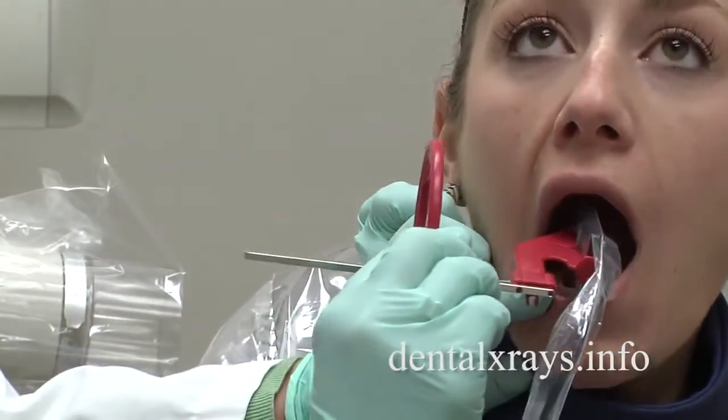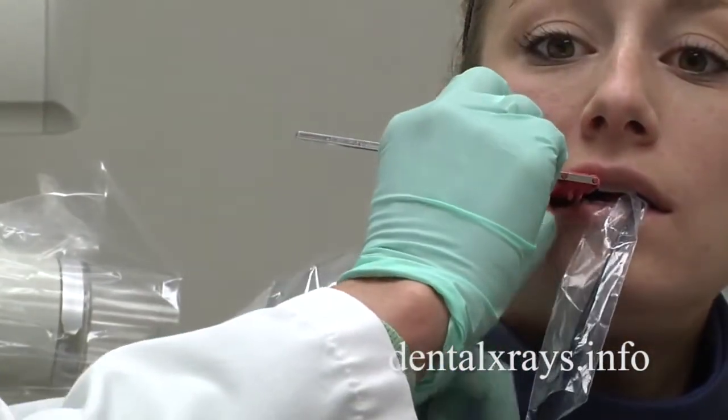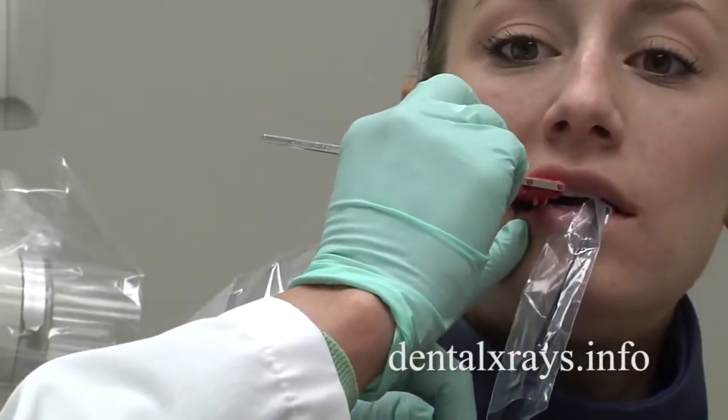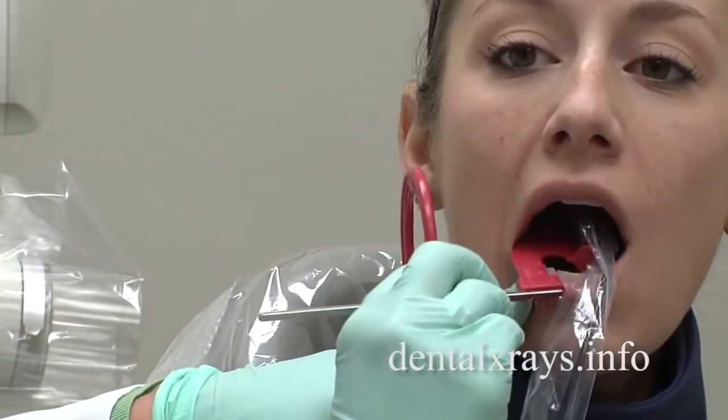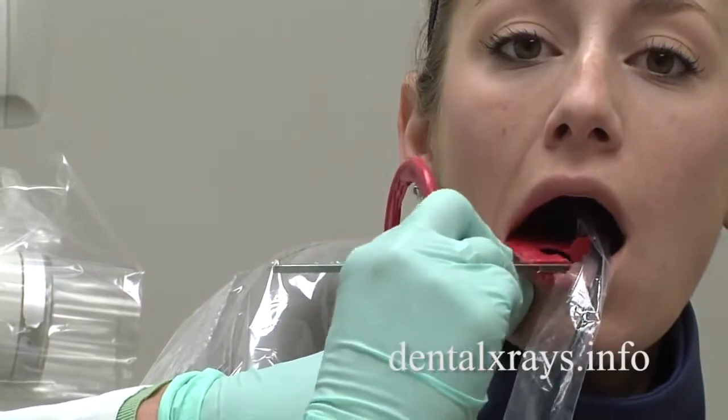However, when we're doing the premolar view, if I just move it toward the middle of the mouth and she bites down, I don't see the distal of the canine. So what we have to do is put it toward the middle of the mouth and then do what I call a cross arch.